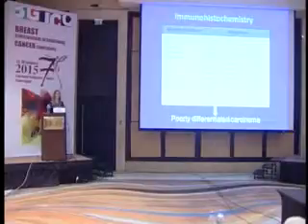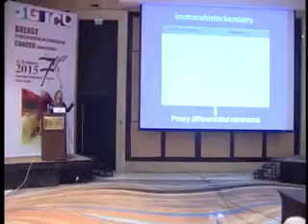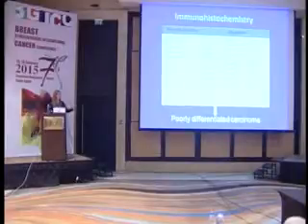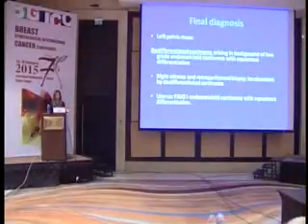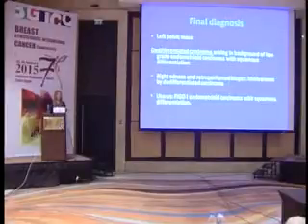So what does it mean for this patient? She has an endometrial carcinoma so well differentiated that even I was hesitant to call it. I called it atypical complex hyperplasia with squamous differentiation. And the ovary went crazy. So what's that? Apparently, I was not by myself. In the literature, they call it de-differentiated.